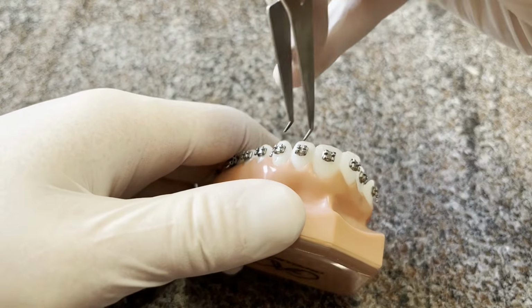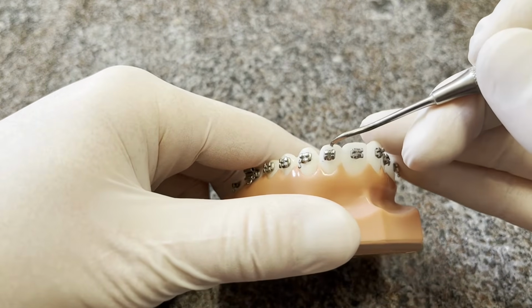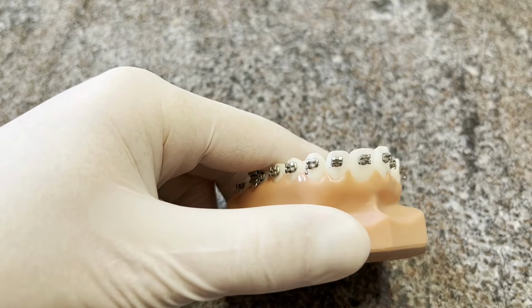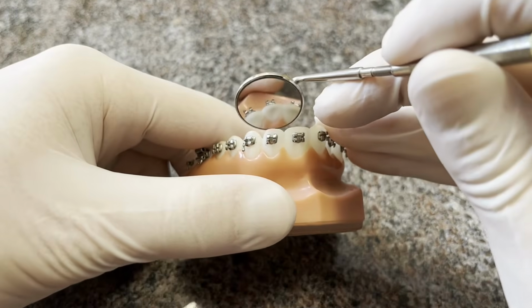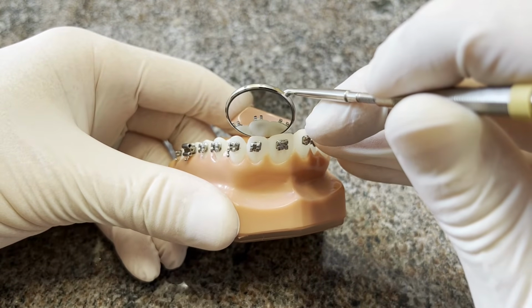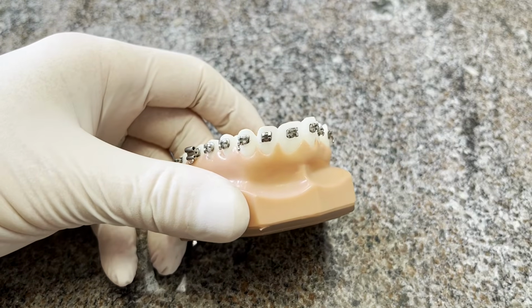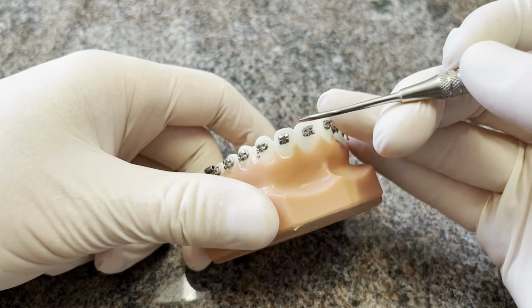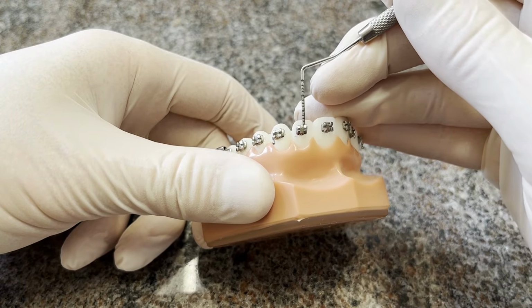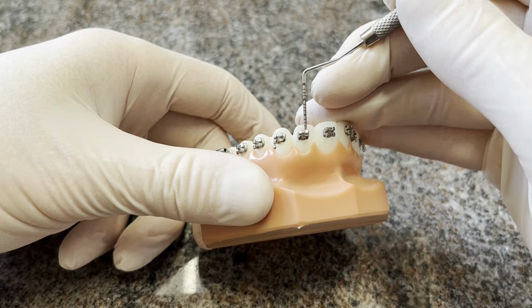And then you go on to your 2, you place that, you eyeball it so it's about in the middle of the tooth. It looks like it's about 1.5 millimeters from the edge. Squish it into place by pressing on the center, clean up your flash. Look from the incisal edge to make sure that it's rotationally correct. The slot of the bracket, or the wire slot, is parallel to the edge of the tooth. And then you look at it with your eyes to make sure that that's parallel to the long axis of the tooth. And then you measure from the edge of the bracket to the edge of the tooth. This one is at about the underside of the 2. I'd move it up so it was about to there, at about 1.5-ish.